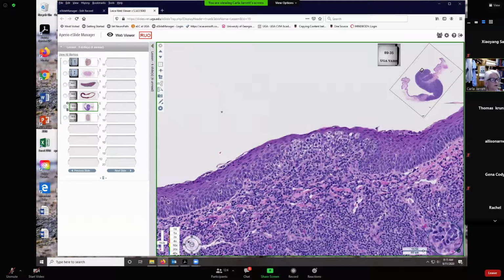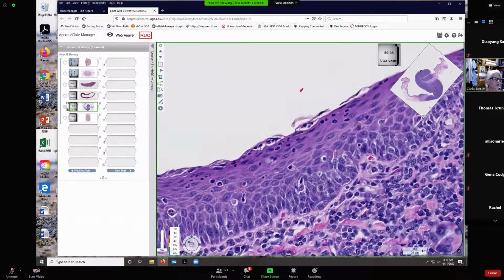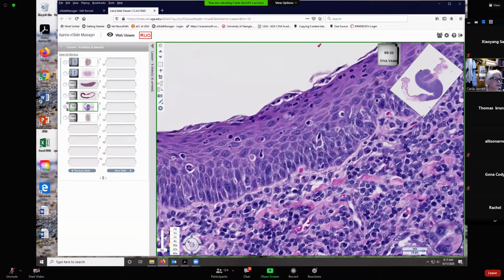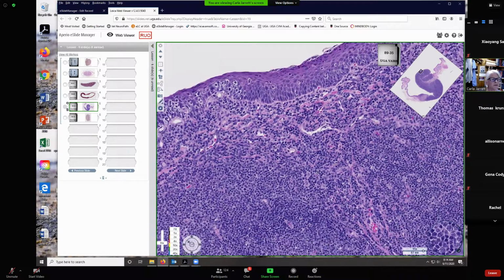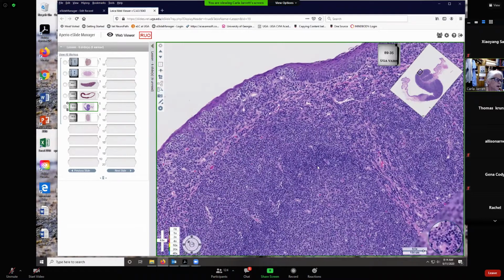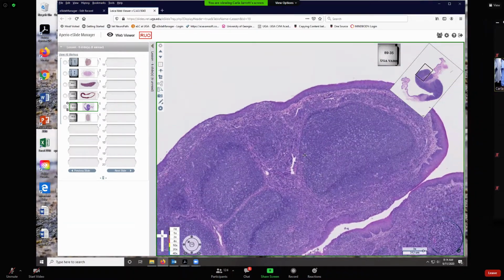And then if you drive around, oh, wow, look here. That's where the diffuse lymphoid tissue, looks like a lot of T lymphocytes, are migrating up into that stratified squamous epithelium. You can even see some dead granulocytes here in those intercellular spaces. Those will be sloughed as these squames are sloughing. Here you can see some squames sloughing right here, and you can see these dead granulocytes and lymphocytes sloughing, mostly granulocytes that die and slough. Lymphocytes are more long-lived.